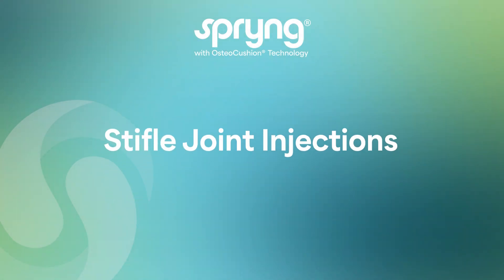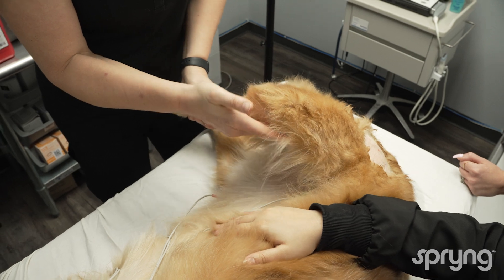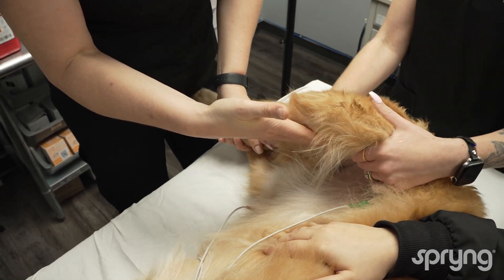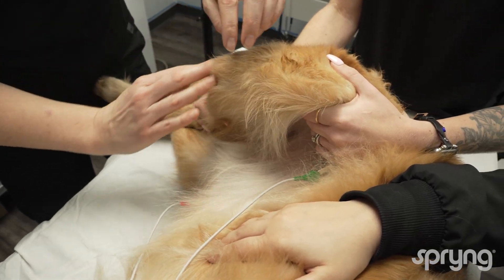Stifle joint injections. Begin by sedating the patient, placing the patient in lateral with the affected limb up. Have the assistant abduct the limb at the hip and flex the stifle to approximately 90 degrees.